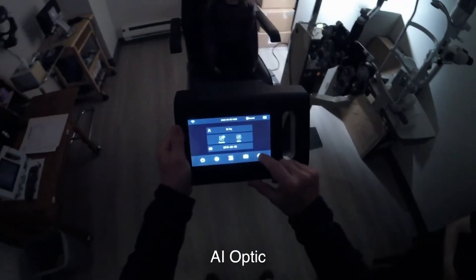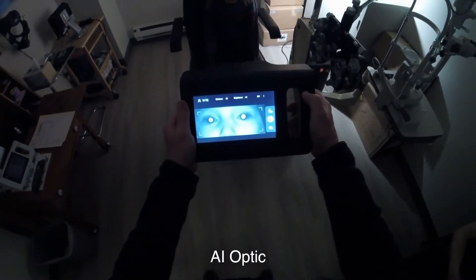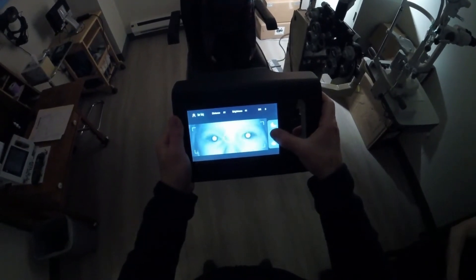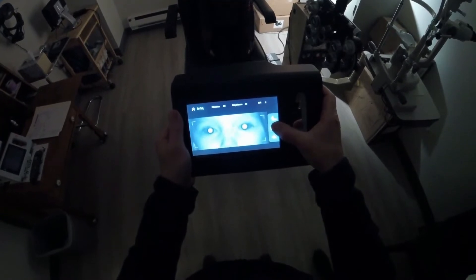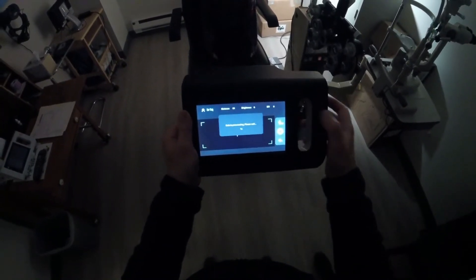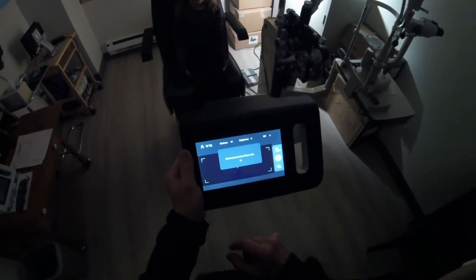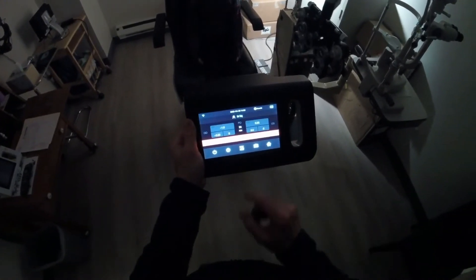Now what we're gonna do is take a look kind of like this. It's gonna see you at about this distance here. See if you can see anything pretty in there. Data processing. This is a Chinese special version of this device, and it says more farsightedness on this side than this side.